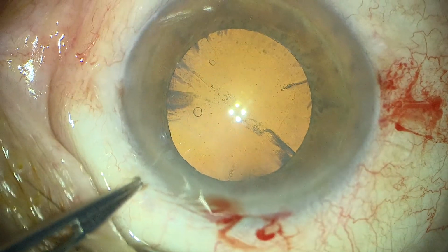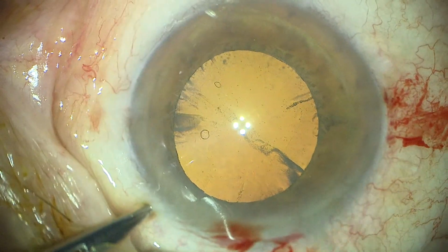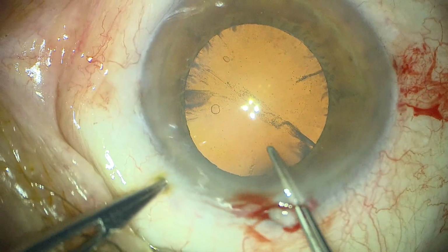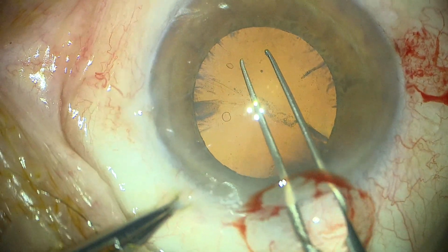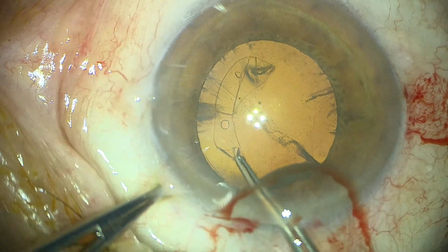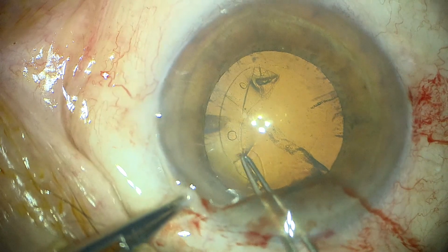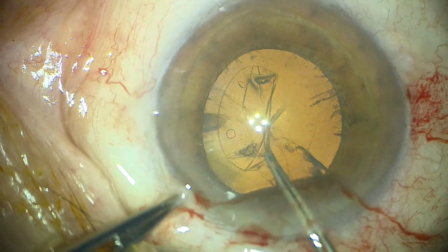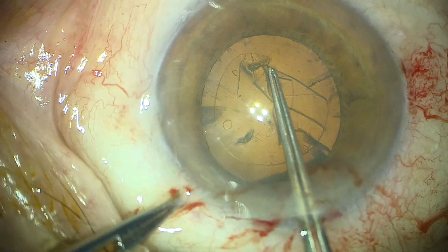I would like to present a case of cataract surgery in a PEX pseudoexfoliation eye. You can see the PEX material on the anterior capsule, and we start with pinching the capsule. Actually, if in a PEX case we see folds while pinching the capsule, we should avoid it and use a sharp instrument to penetrate the capsule without pulling the weak zonules.